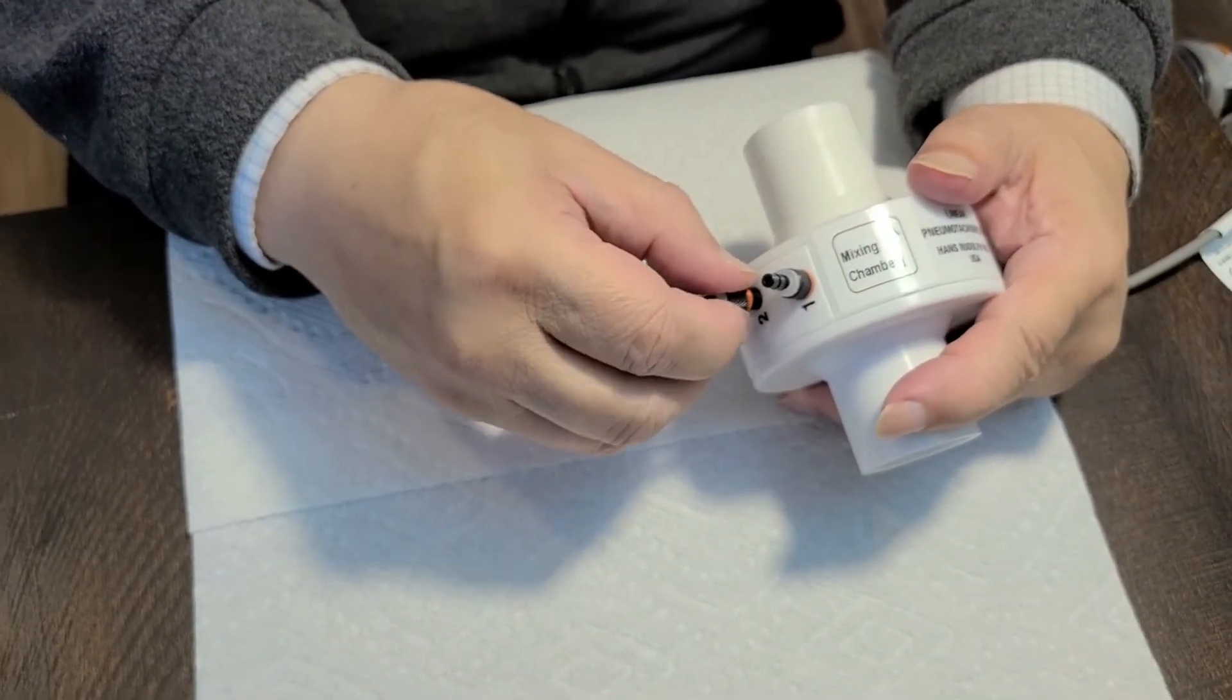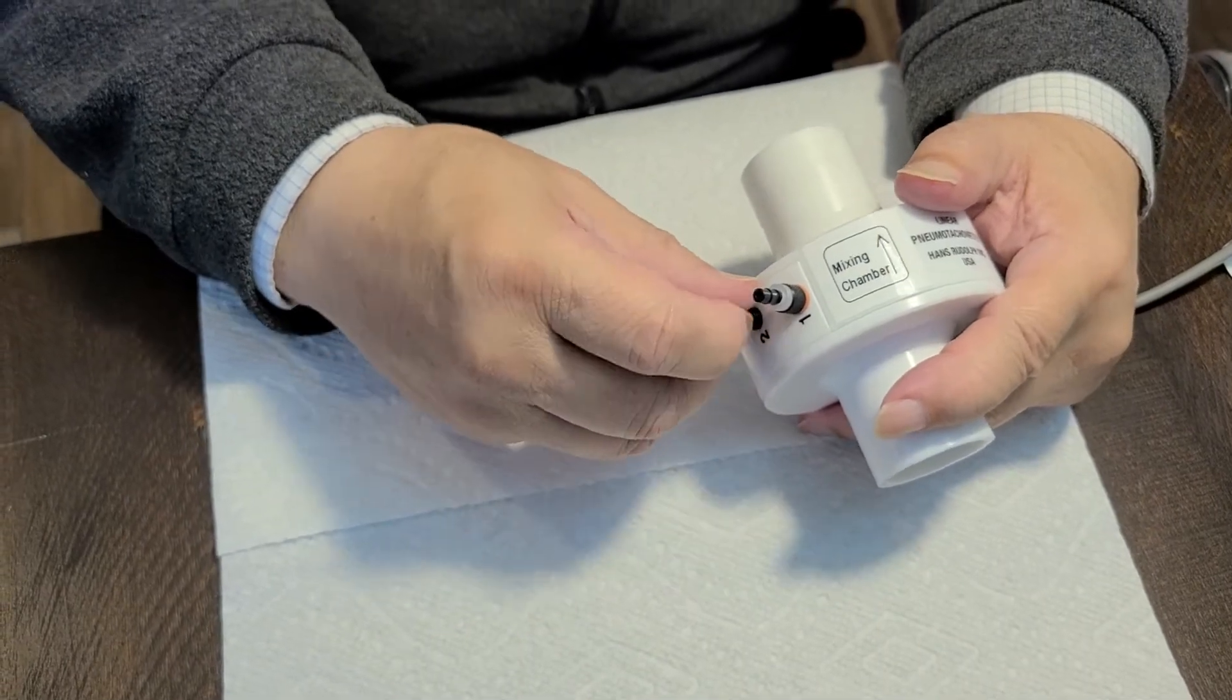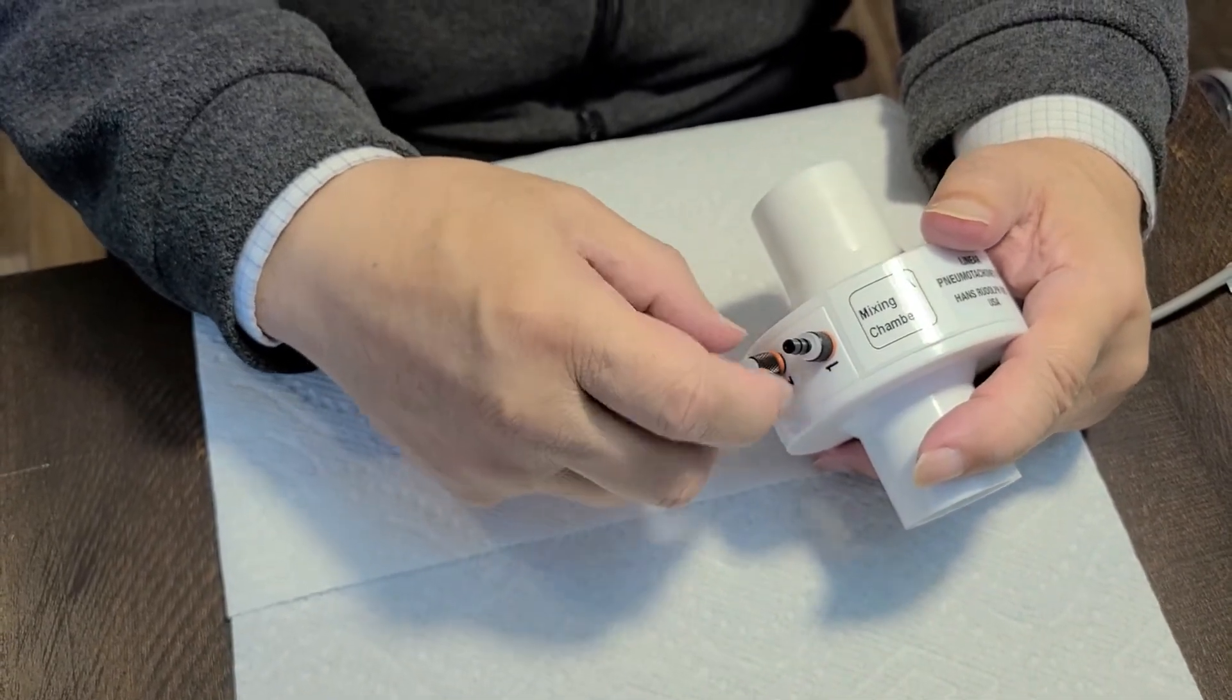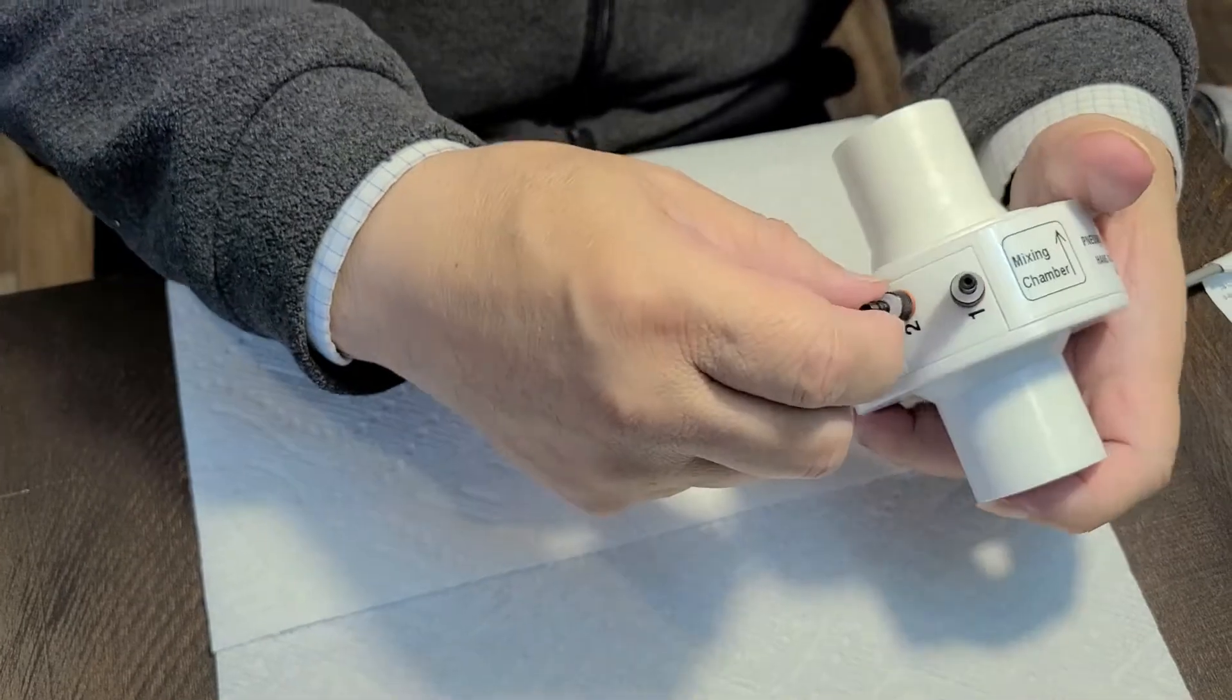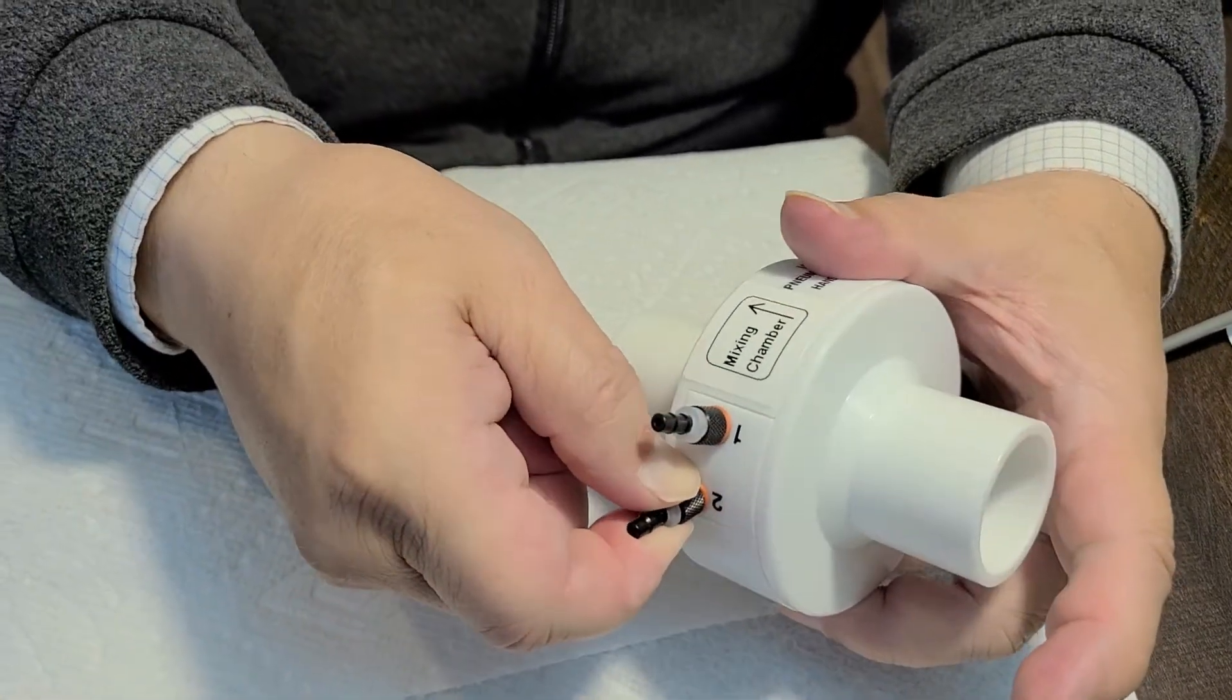And then the other black connector. Again, touch the orange o-ring. Turn about 90 degrees.